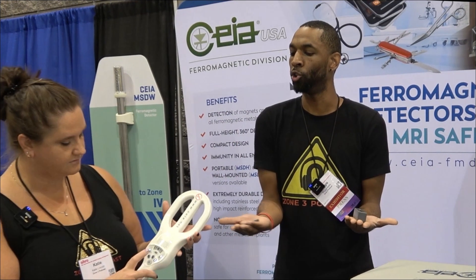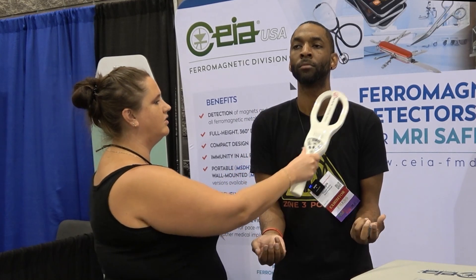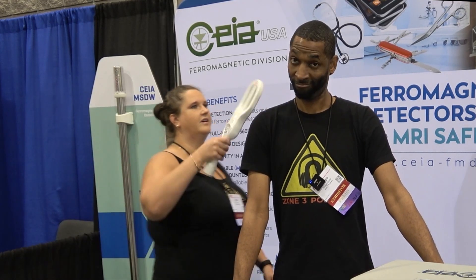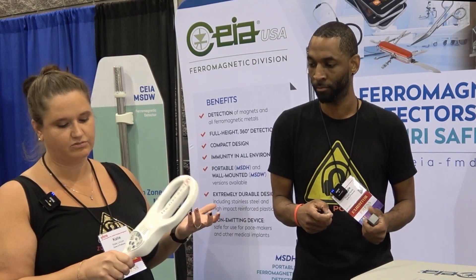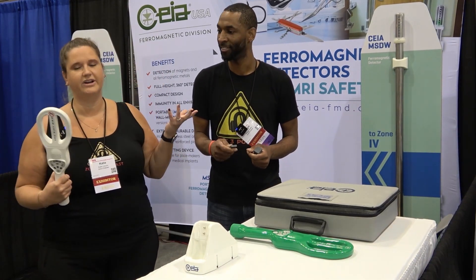What type of scenarios do we use that at work? We'll use these on every patient that comes in to have a scan. The key is to go slowly. We'll go over the body and scan their whole body. Reggie's wearing jeans that have a metal snap, and he has a wallet in his pocket too, that also sets off the detector. The vibration mode is really great, especially if you're getting close to their head, so you're not blaring the sound in their ear.